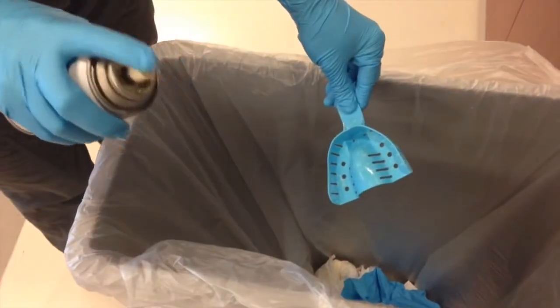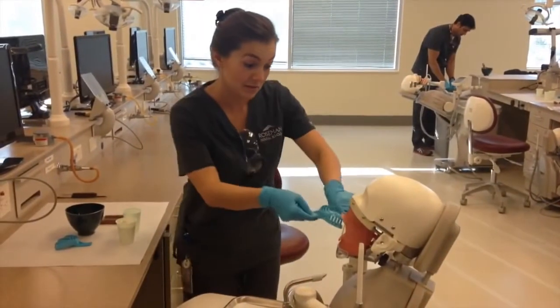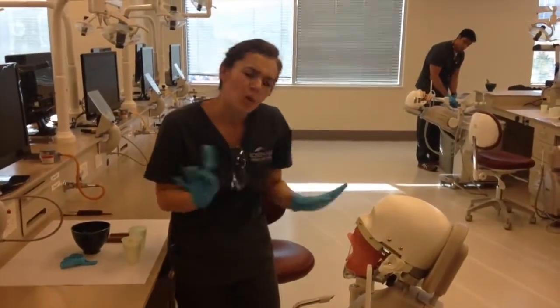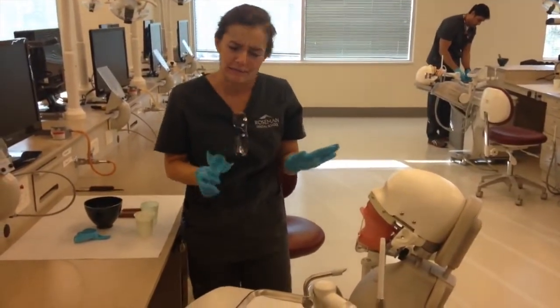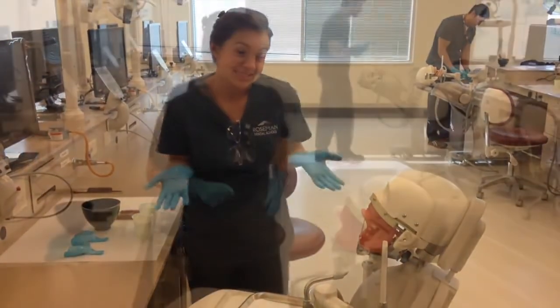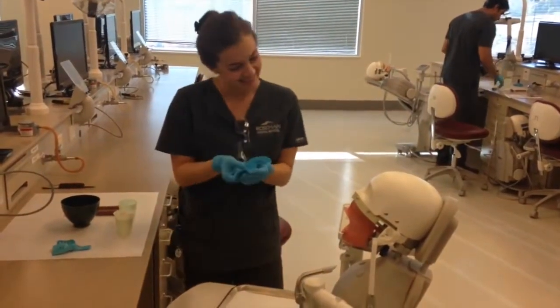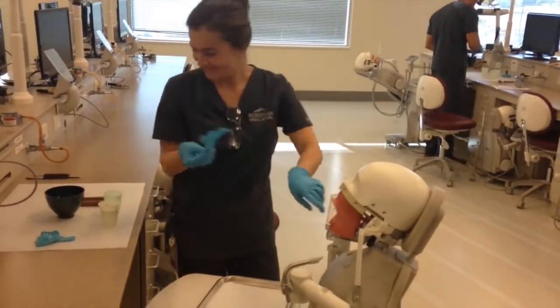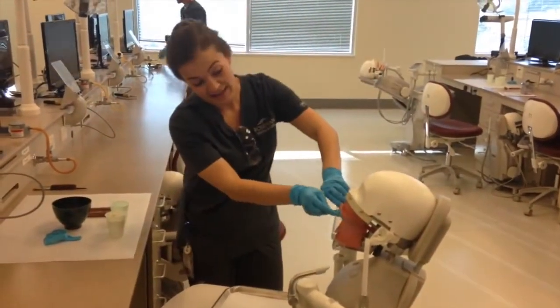The next step is to spray your trays with adhesive. This helps the alginate to not separate from the tray while you're removing it from the patient's mouth. You don't want to explain too much to your patient — it might scare them. Much better.